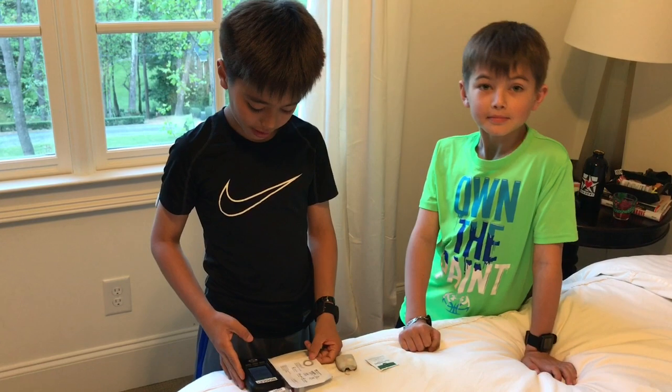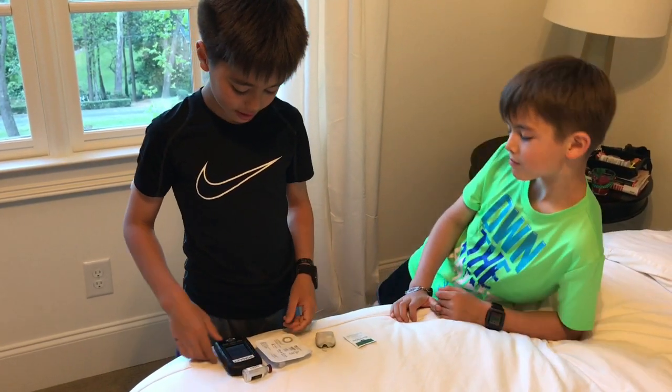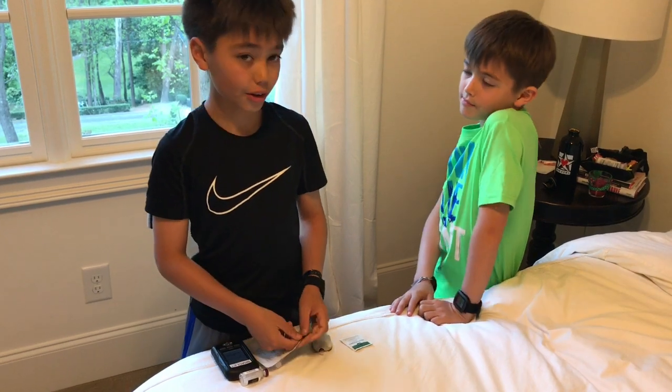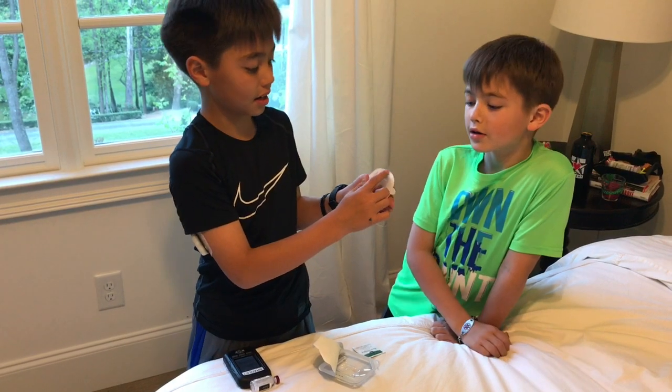It says fill a new pod with insulin. After filling pod, listen for two beeps, then press next. Do not remove the needle cap at this time. This here is the needle.